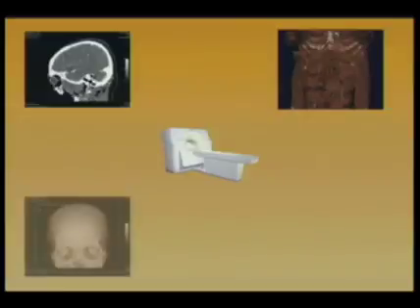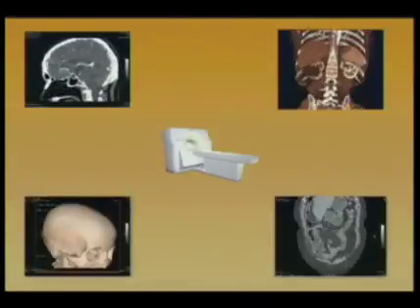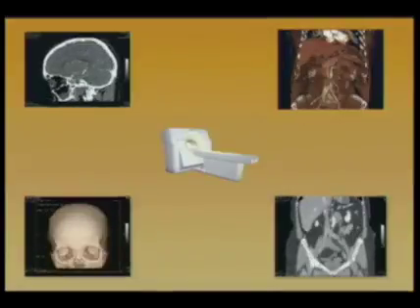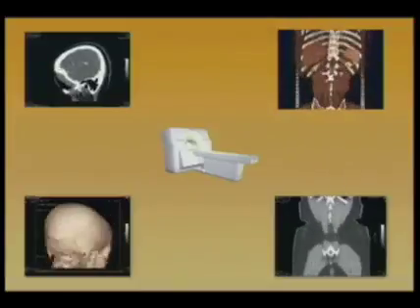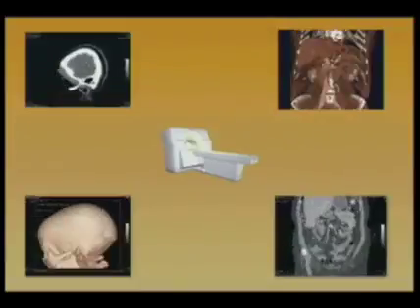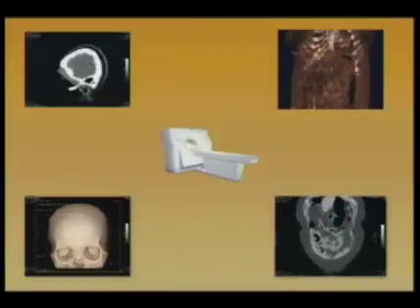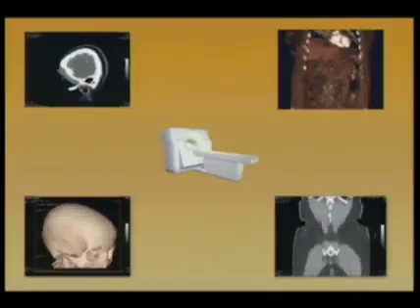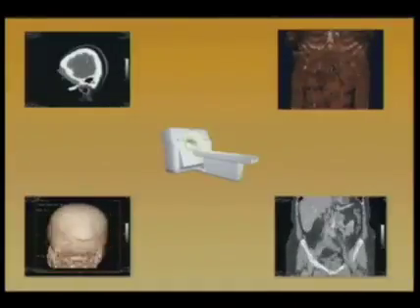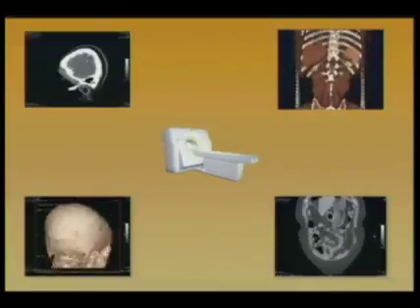I think most of you are familiar with the multiplanar reformatted and volumetric images that we obtain from CT and MR, and certainly those are widely available now and spur people who deal with ultrasound, who've only been used to looking at two-dimensional images, to ask themselves, why can't we do the same thing with ultrasound in the abdomen?